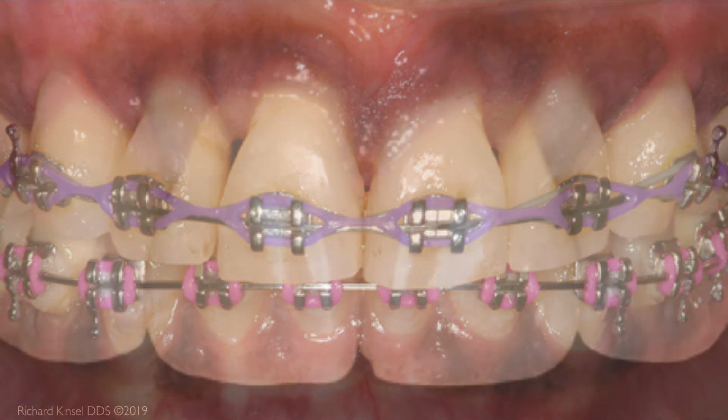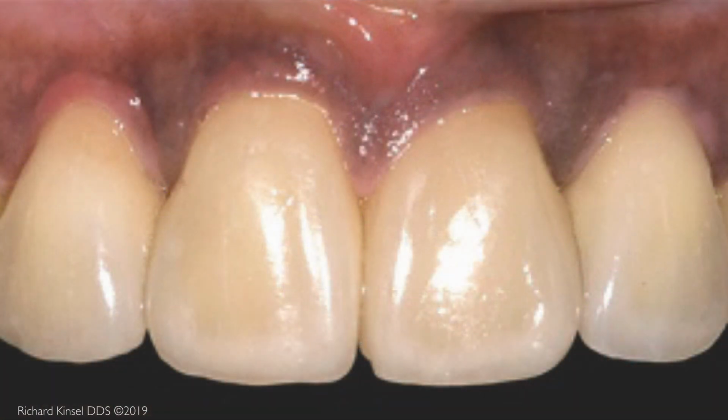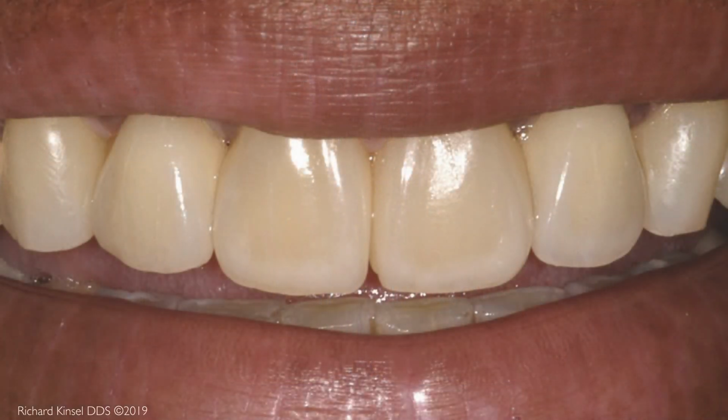Simply changing the contours of the porcelain veneers between the teeth allows the gum tissue to fill in and eliminate the black triangles. The patient's smile reveals the aesthetic importance of closing the gum spaces that were previously visible.